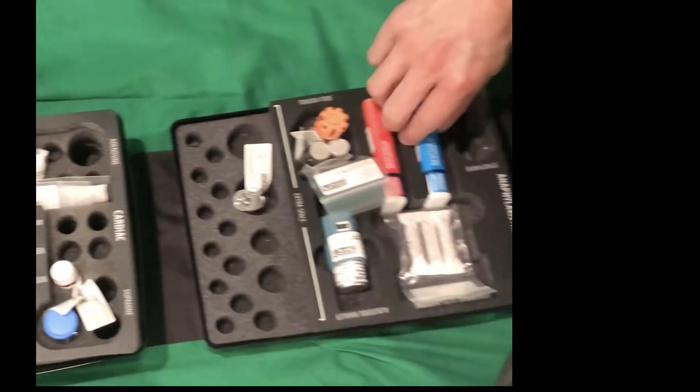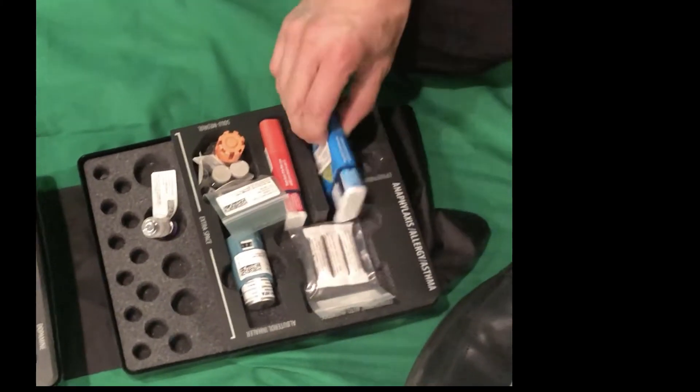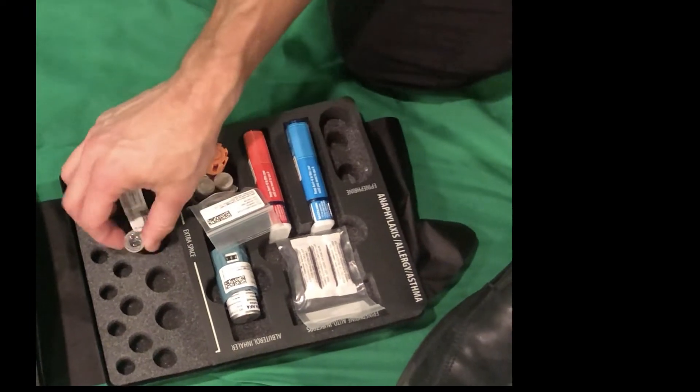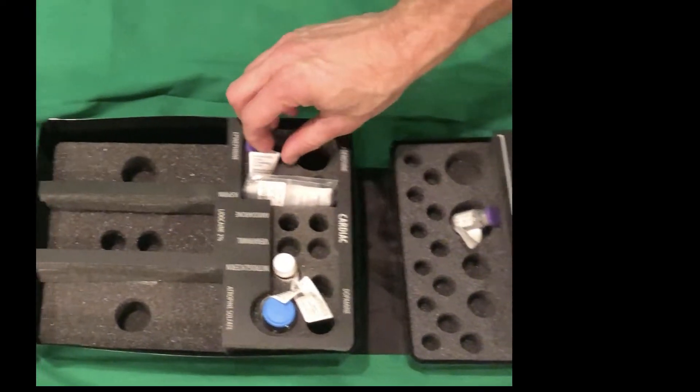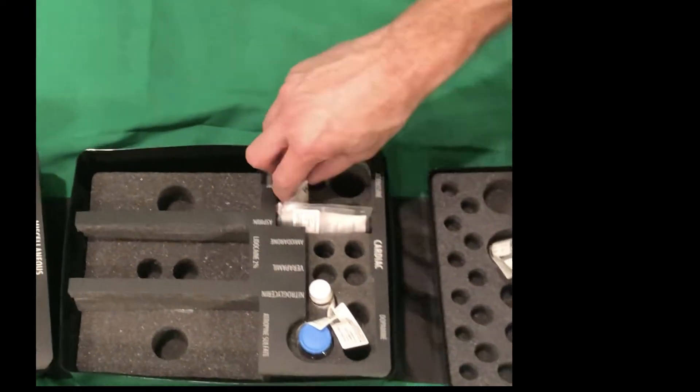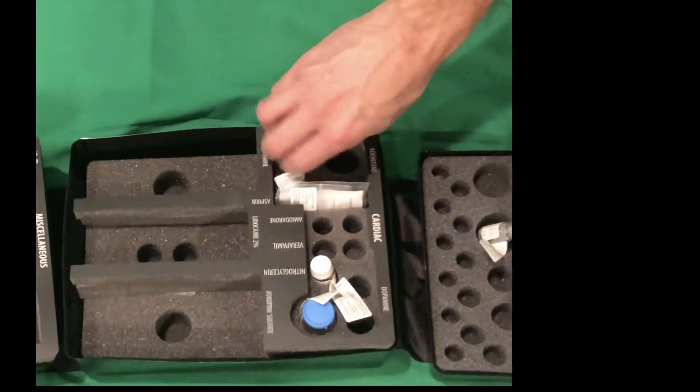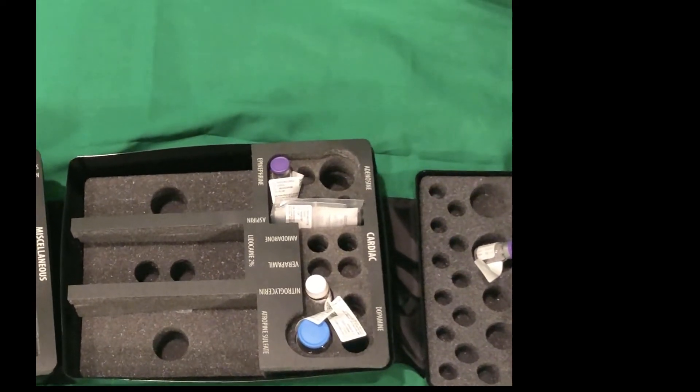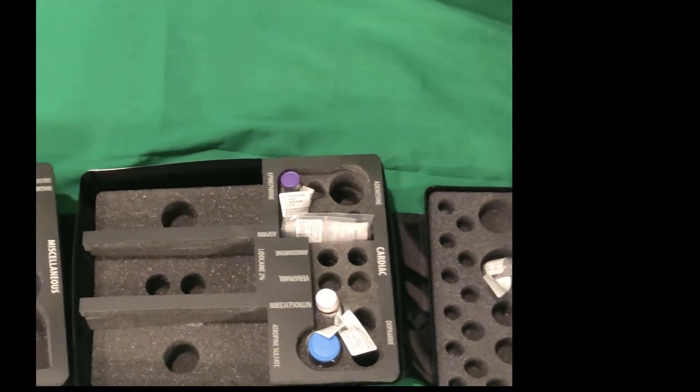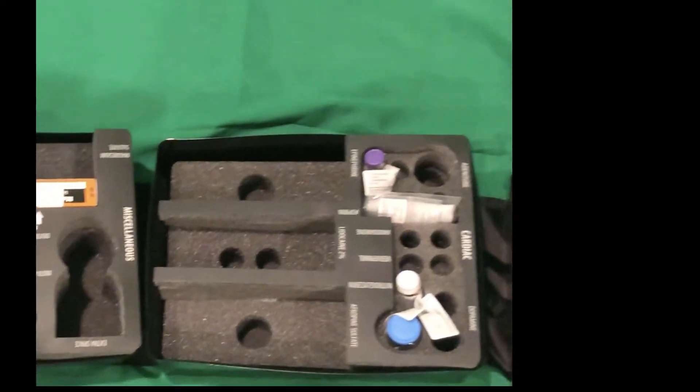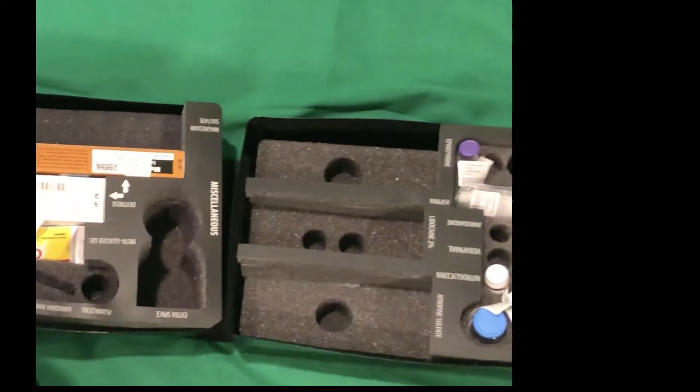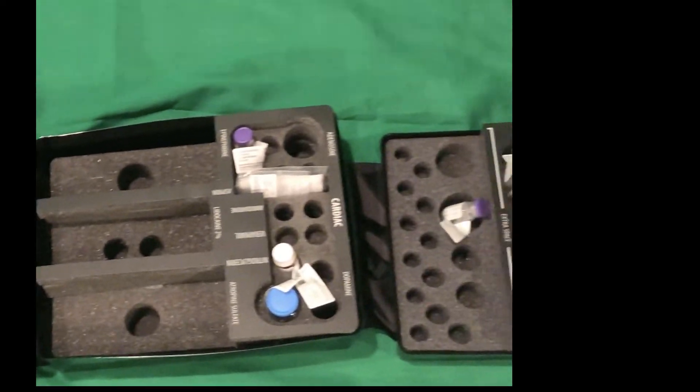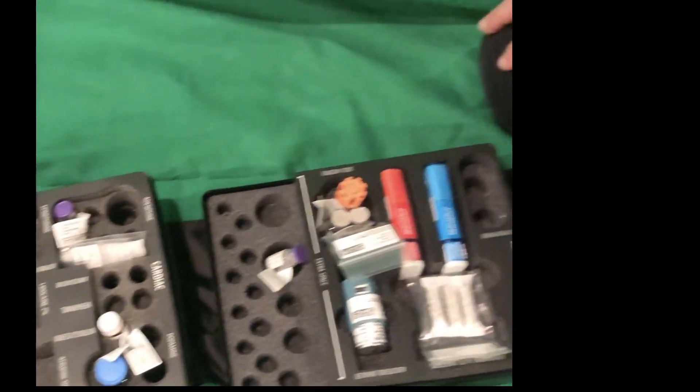Closer towards the front are Epi Auto Injectors, as well as Epinephrine for managing a patient with cardiac arrest. These are the particulars of the Emergency Medication Kit. There's a demo kit that you'll be using for your simulation training.